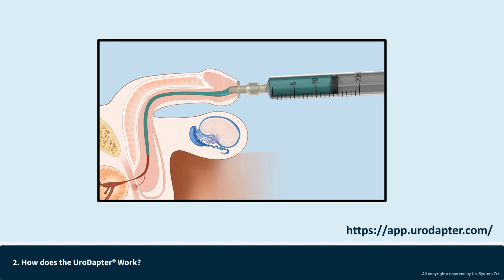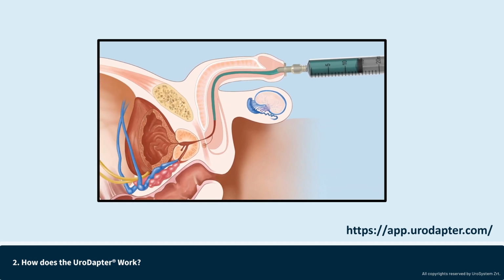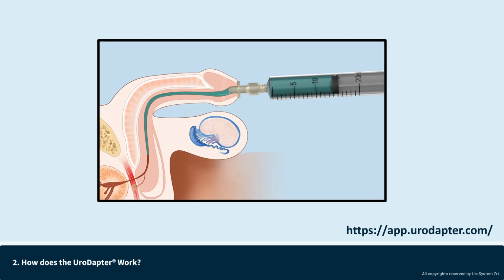Just like in female patients, during proper instillation, the instilled solution will increase the intraurethral pressure above the sphincter pressure and will completely open the already relaxed sphincter, allowing the solution to easily flow into the bladder. The amount of pressure in the urethra during instillation is very similar to the intraurethral pressure during spontaneous urination and does not cause any problem.